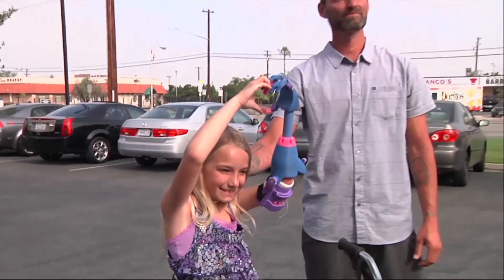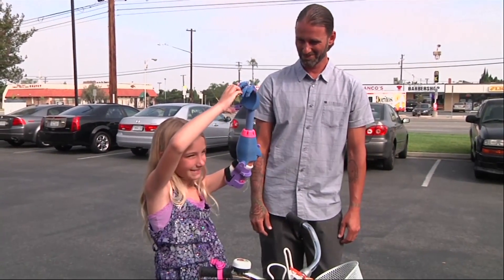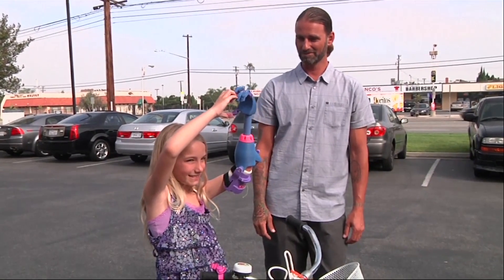Nice to meet you. Let me see your heart. There you go. Hold it up. Beautiful, baby. Good job. Great job, baby.